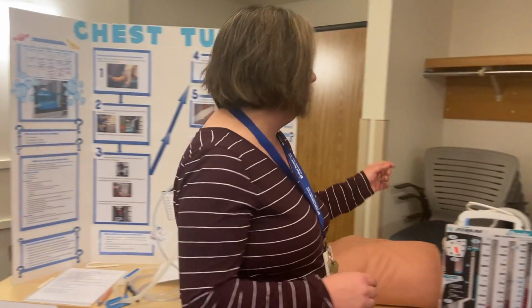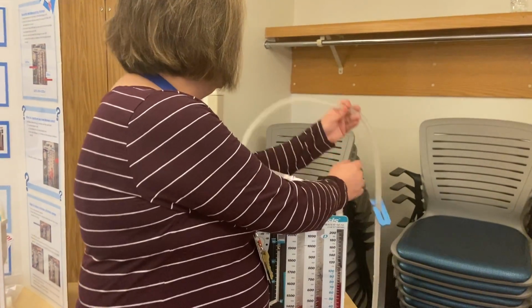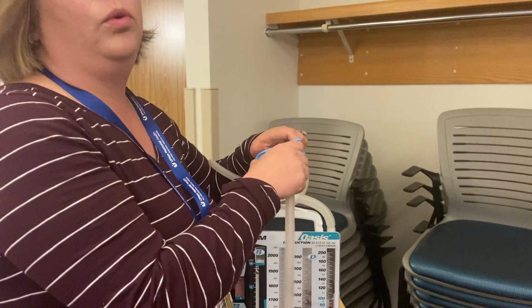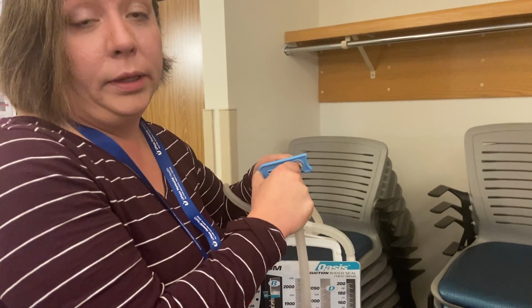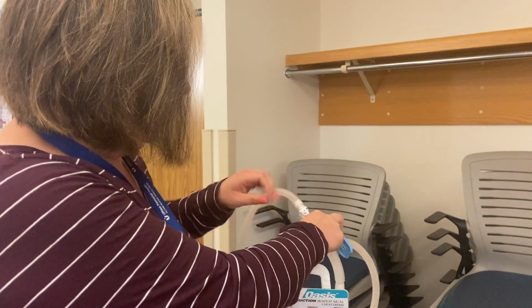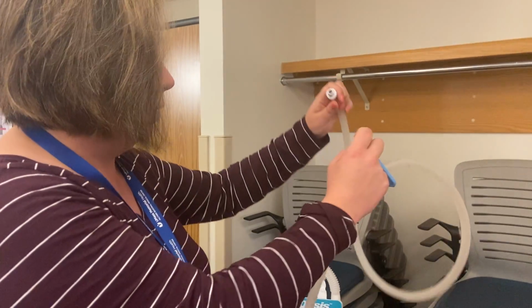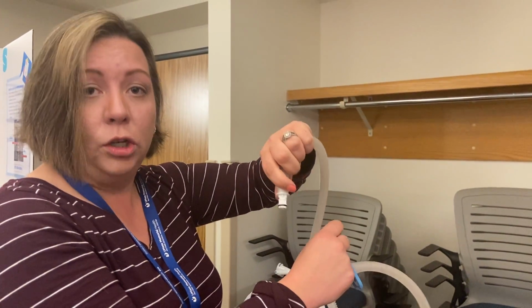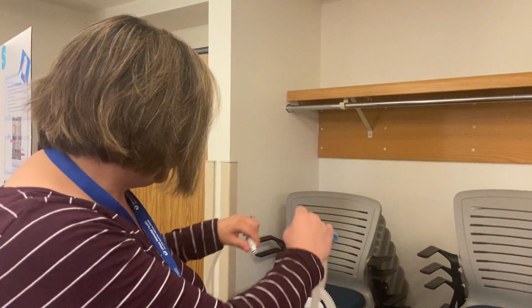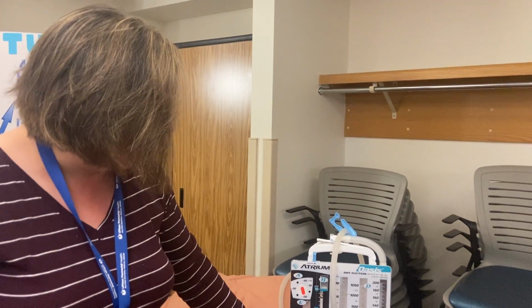So something you can do, you can clamp it at this point. This is really the only time you're going to use this clamp. You would take this off and clamp it just so that you're preventing any air from getting up into the patient, and then hook this onto a new canister, okay? And then you would want to make sure, obviously, you filled your water seal.